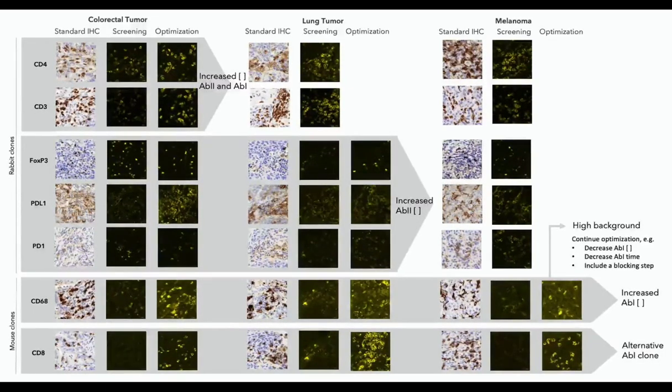To conclude, tonsils helped set the starting point for many markers during the optimization of our multiplexing protocol. However, when transferring to specific tissue types, a subgroup of the markers require further adjustment. Our technology allows for testing of multiple conditions in series with limited need of transferring the samples from a stainer to a scanner, avoiding many manual steps of cover slipping and decover slipping.